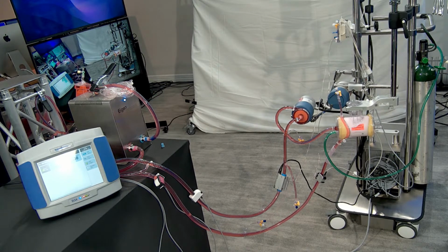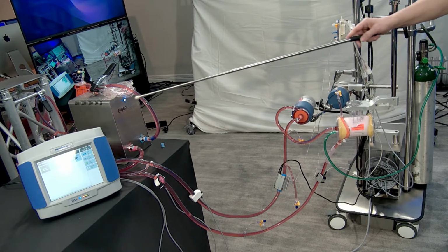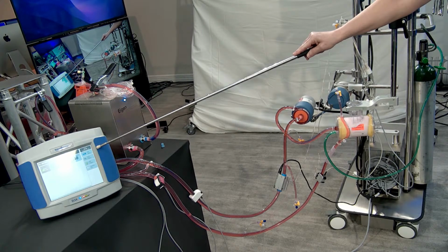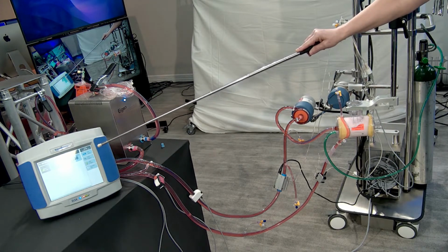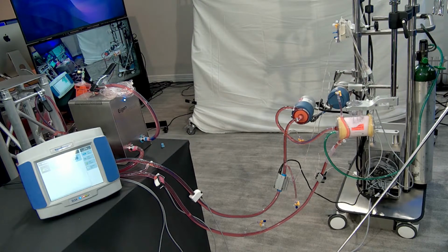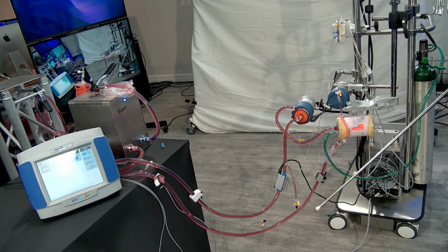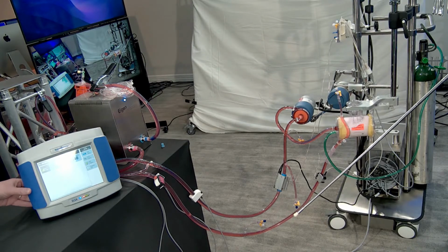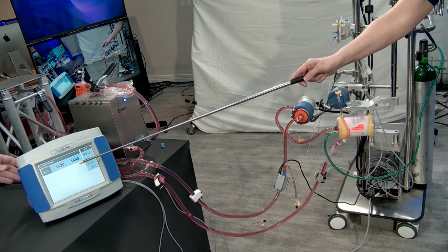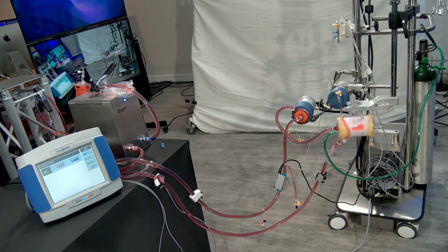Could you show the ELSA meter, by the way? Sure. This is the Transonic ELSA meter. Right now we have it set up just to be monitoring flow. The blue is showing the venous or access flow, and the red is showing the return flow. It's whited out a little bit because of the light. There we go. So blue is the venous or access, red is the return or arterial, depending on your configuration of what type of ECMO support you are providing.